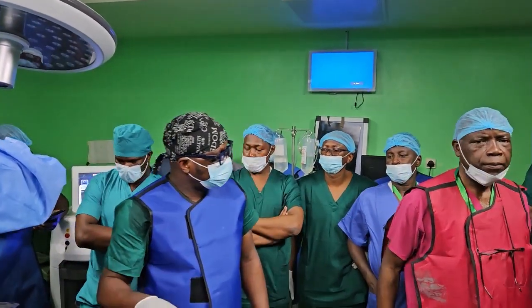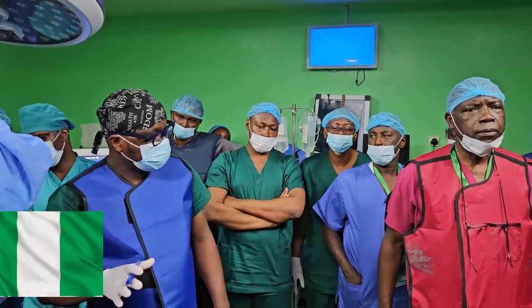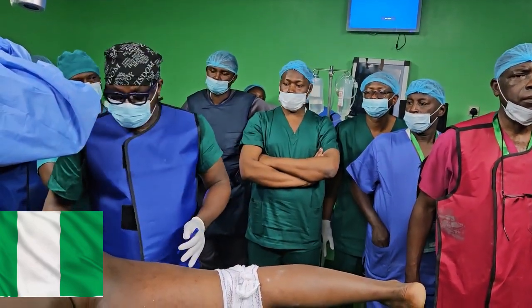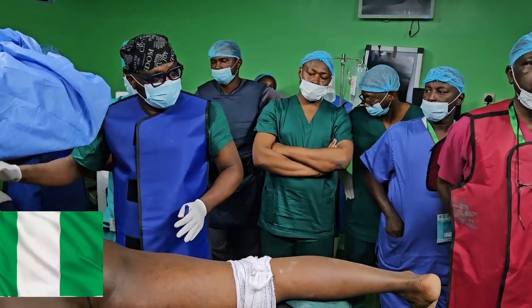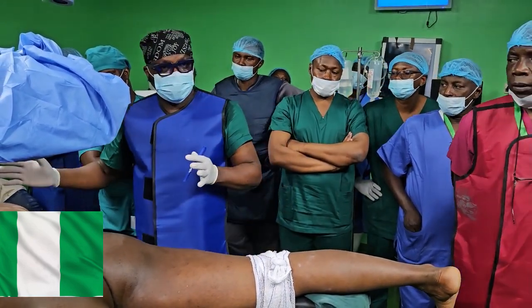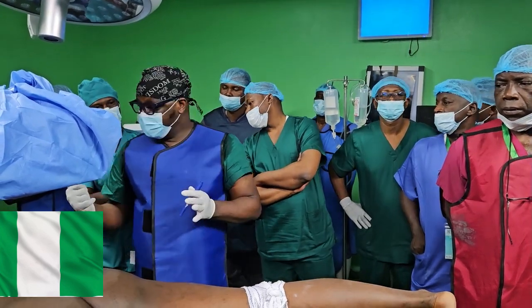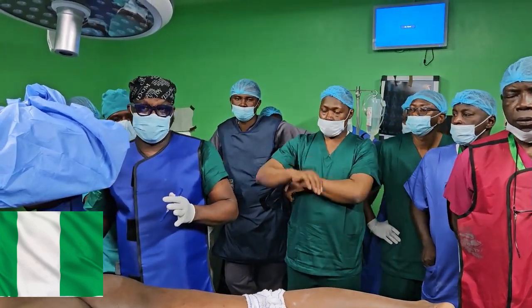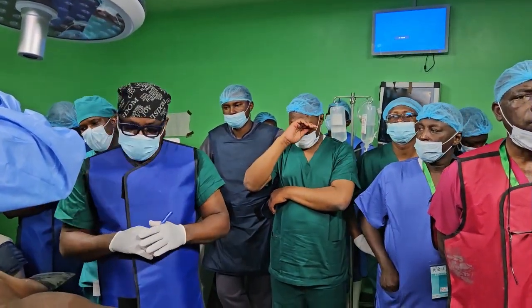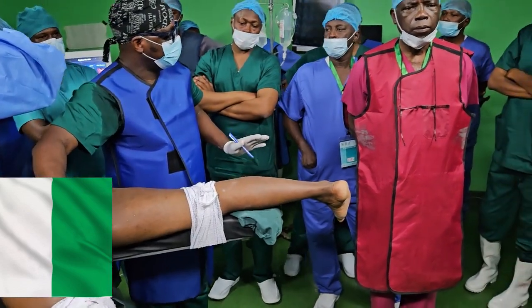Yes, so the positioning is prone, split leg positioning. There are very important points. We are not using bolsters. It's a bolsterless procedure. The anesthetist must use face protection. There have been cases of ocular injury, ocular loss from positioning. So the face has to be well padded, and I always emphasize that to the anesthetist, so that you don't also have facial palsy and all of that. The split leg positioning is so that if we need to go retrograde, we are already prepared for it.